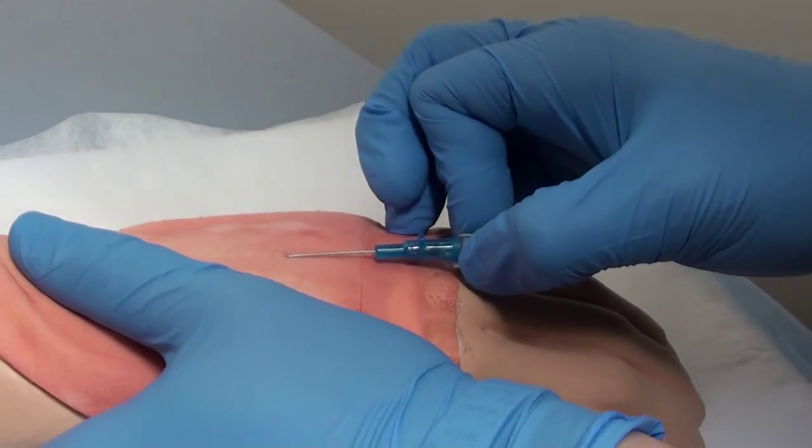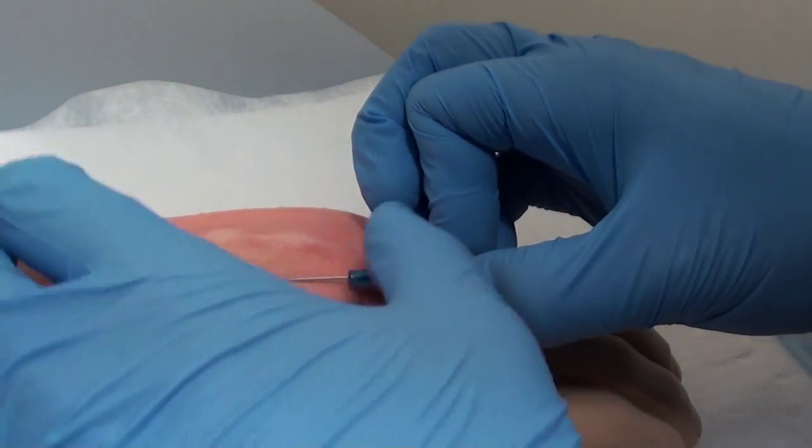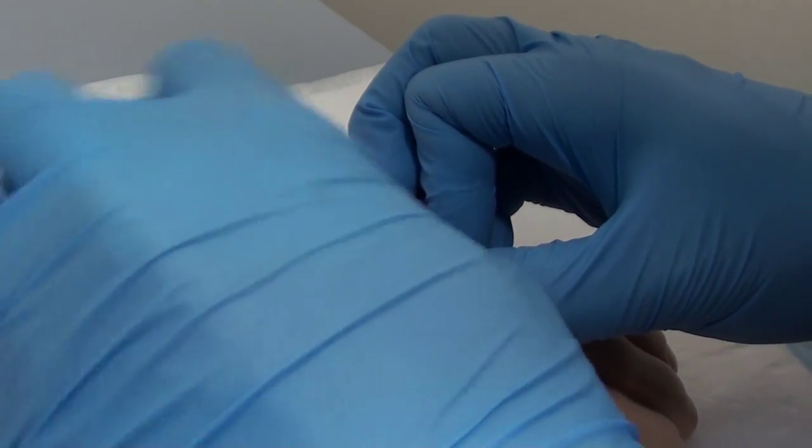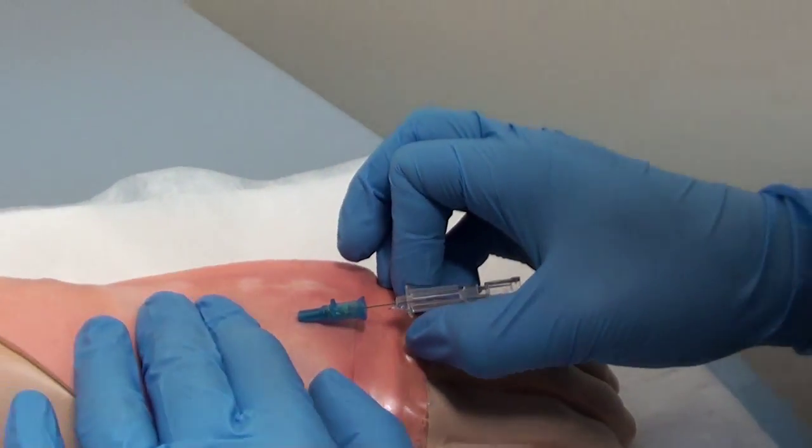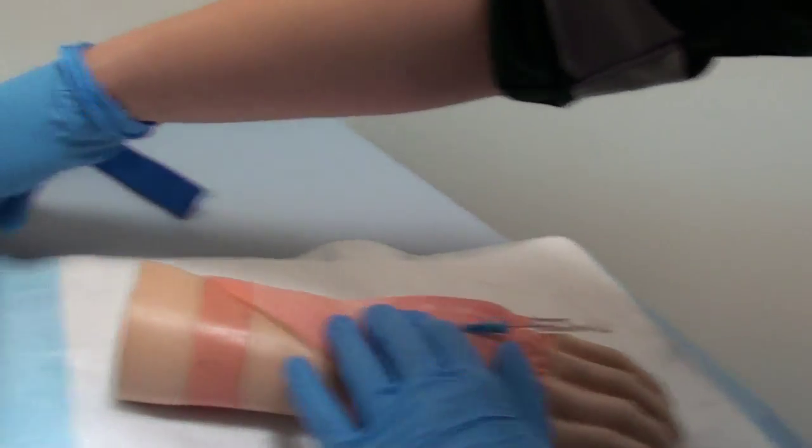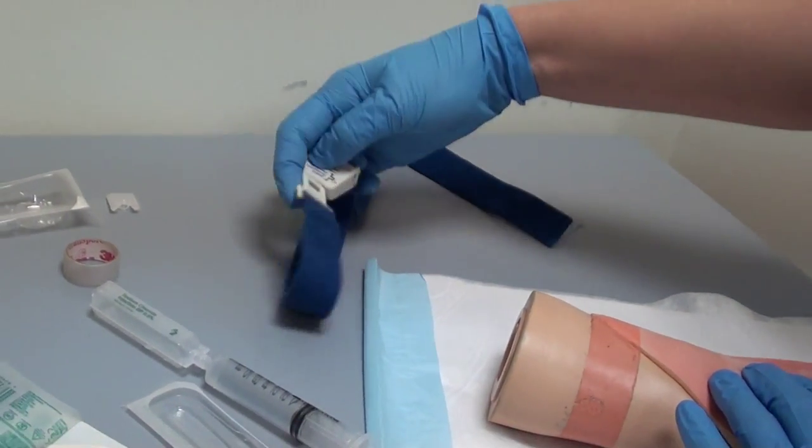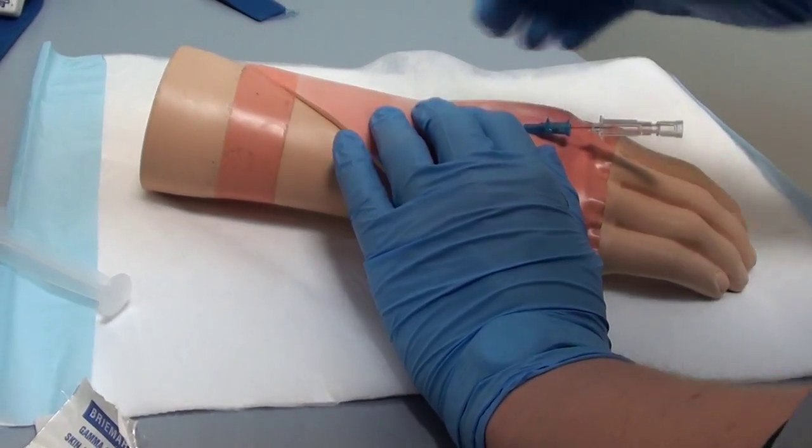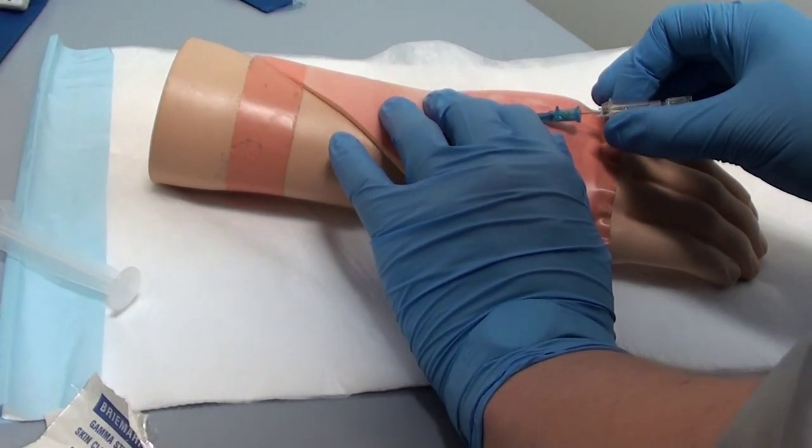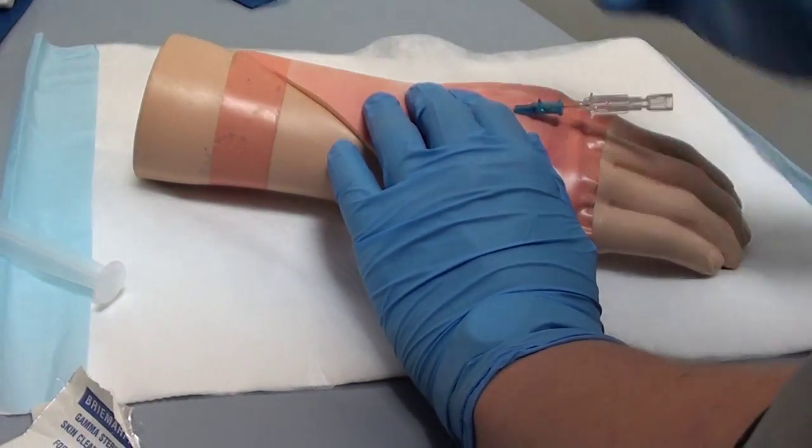That's going in now. Advancing that cannula into the vein. Just to clear that off. Before I remove the sharp, I'm going to release that tourniquet. I'm assuming that I do have flashback. It's an issue with this arm, why we don't have any blood coming through.